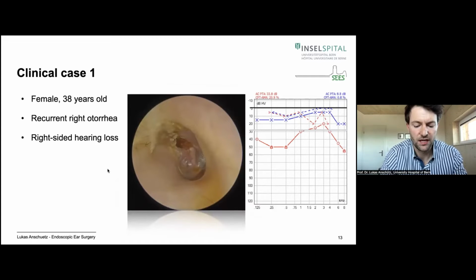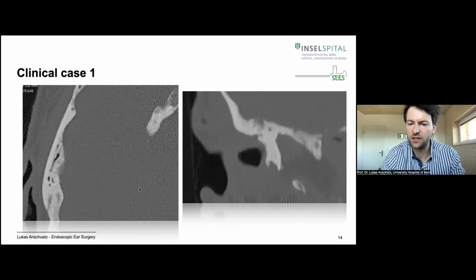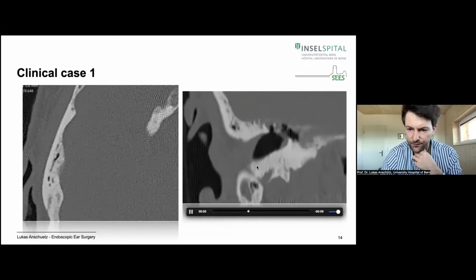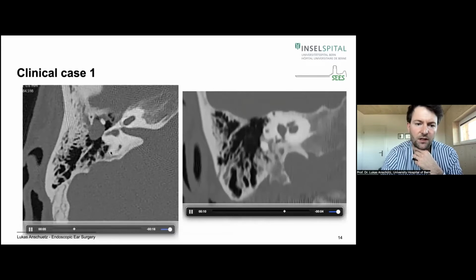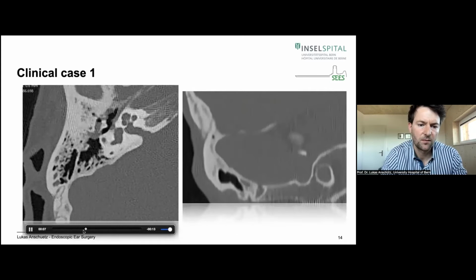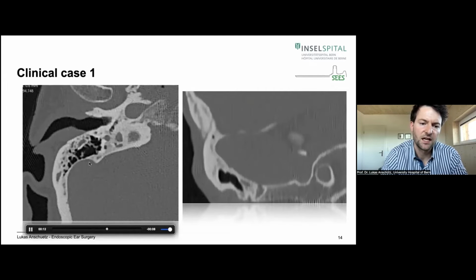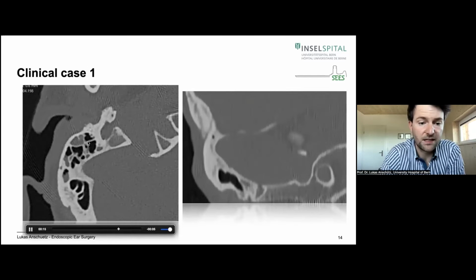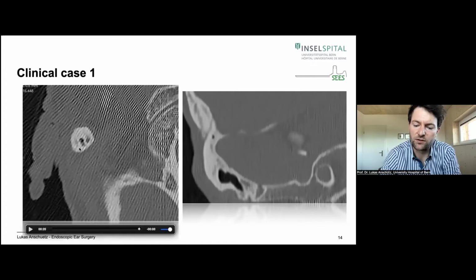Okay, so I told the patient you will need to have some surgery because, of course, the cholesteatoma needs to be removed. And before the surgery, we perform the CT scan. You can see here the coronal view. Here you can see the cholesteatoma. Here you can see it very well, the cholesteatoma. Perhaps I can go back just a second. Here, the cholesteatoma. And you can see the rest of the mastoid, very prominent sinus. The rest of the mastoid is basically normal, just a few cells with a little bit of mucosal swelling in the tip of the mastoid.